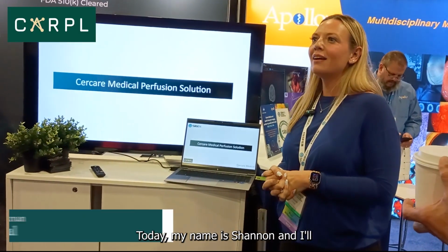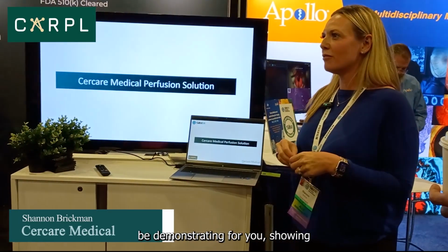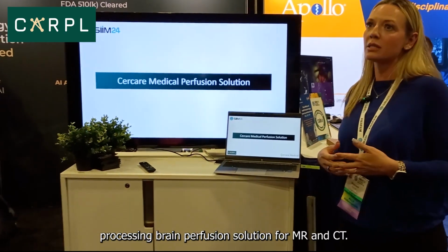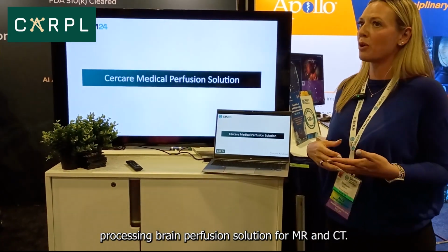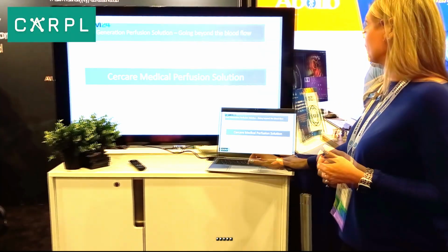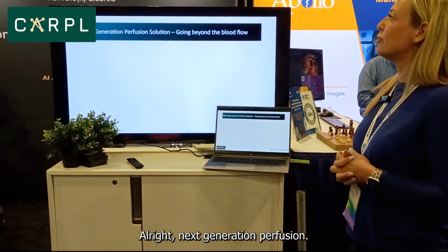Well, today my name is Shannon, and I'll be showing a little presentation about Cercare Medical, which is a post-processing brain perfusion solution for MR and CT. So Cercare Medical: next generation perfusion solution.